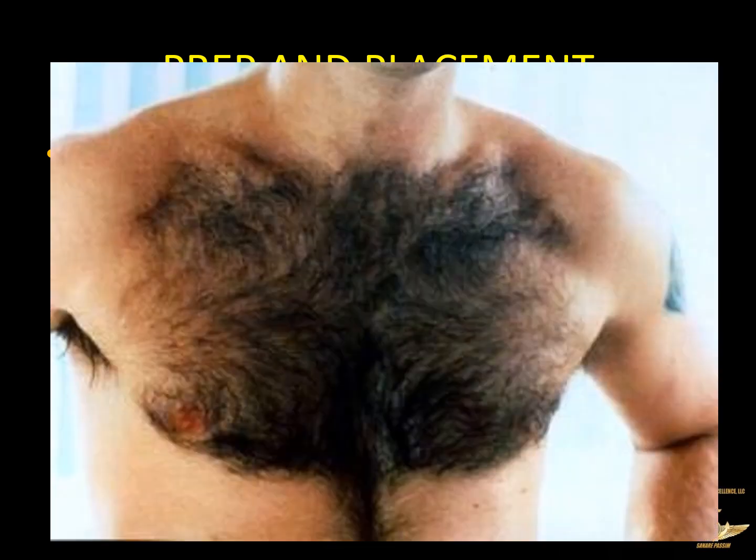So if you look at somebody like this, I'm not hating on people with chest hair. I mean, if I take off my shirt, I look like I'm wearing a sweater. I get it. But if you stick electrodes on this guy's chest hair, they're not going to be touching his skin, and you're not going to get a good electrical signal.